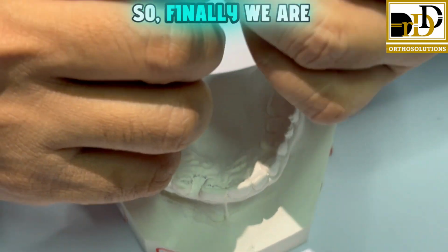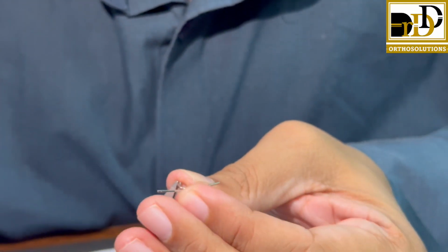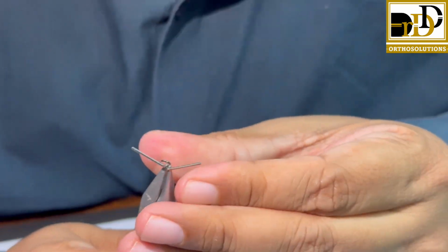So finally we are just closing the loop and giving some more compensation.